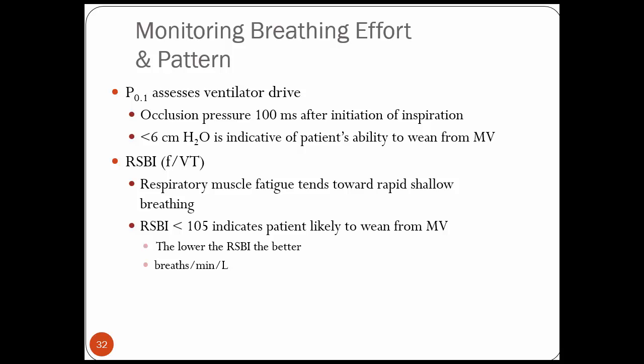Most of the ventilators that have this are the modern day data processor type ventilators, and they have to have this specific test programmed into the software. Less than 6 centimeters of water indicates that the patient is able to wean from mechanical ventilation.